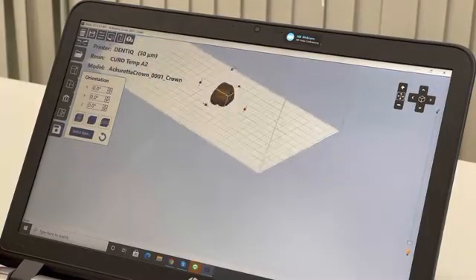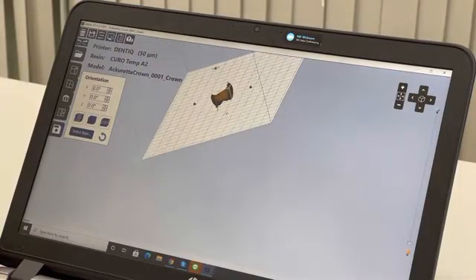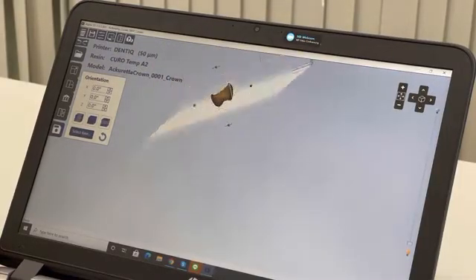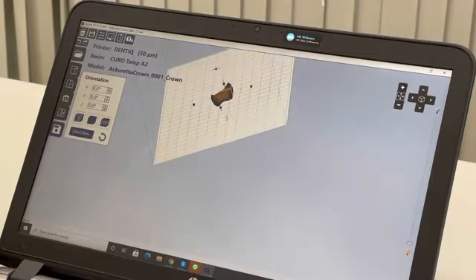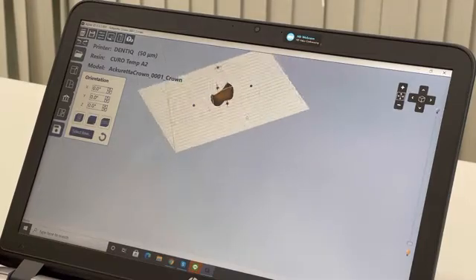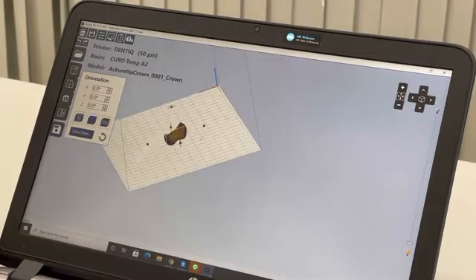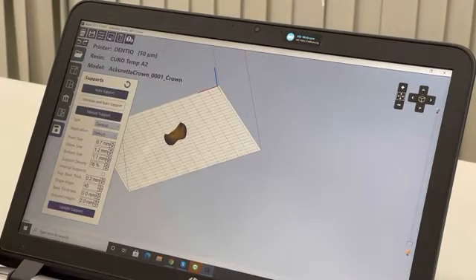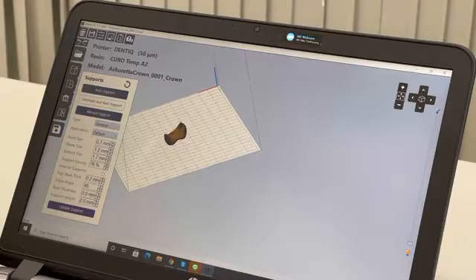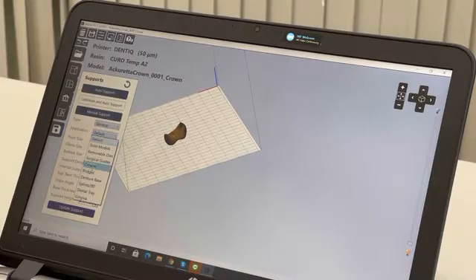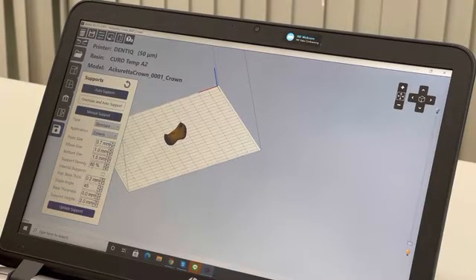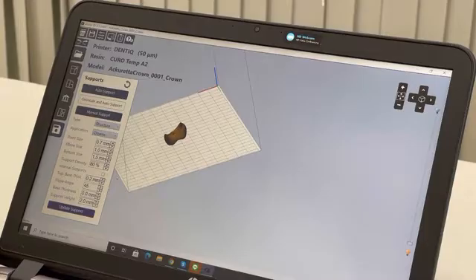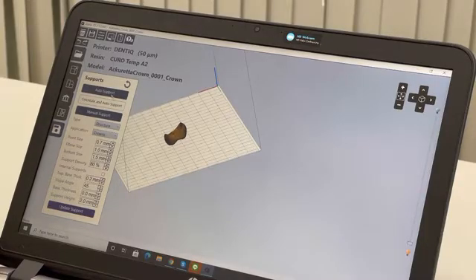Now the less important part faces the build platform. I can now go to support. For this application, we know it's a crown, so I choose the crowns application. It will directly give me the pre-settings. Then I just have to click on auto support, and it will give me the good support for this application.